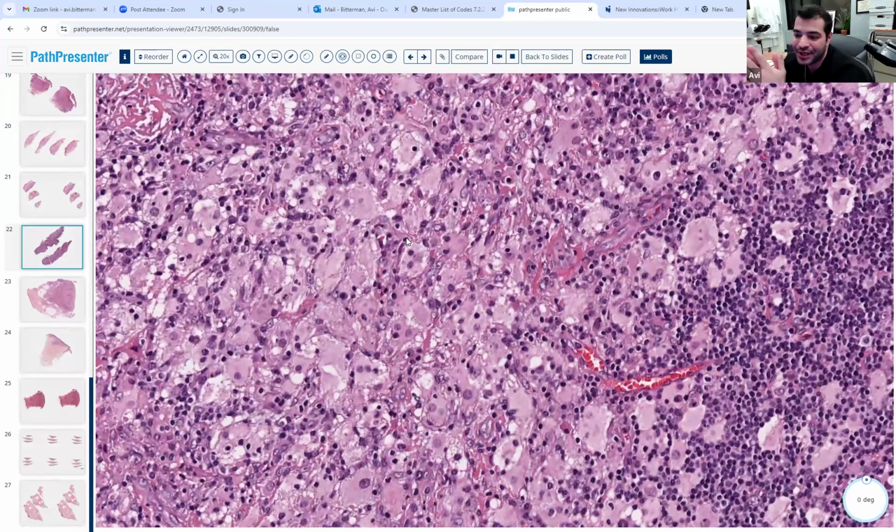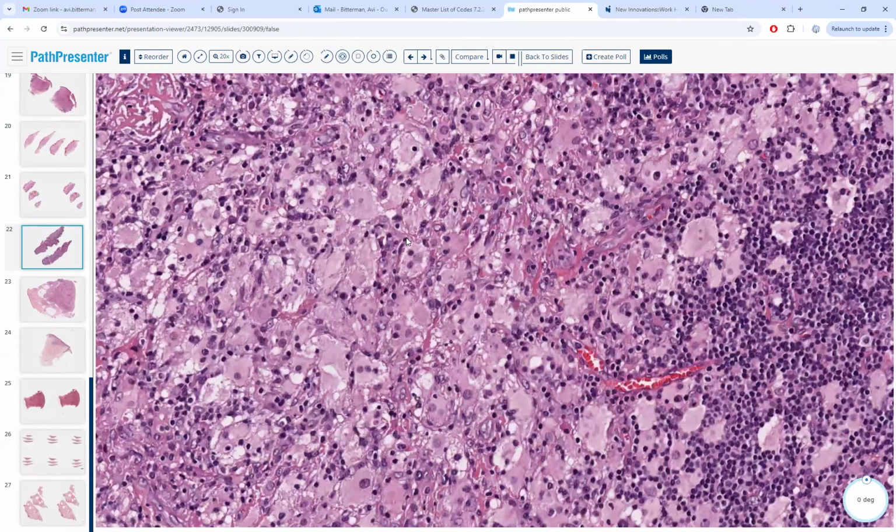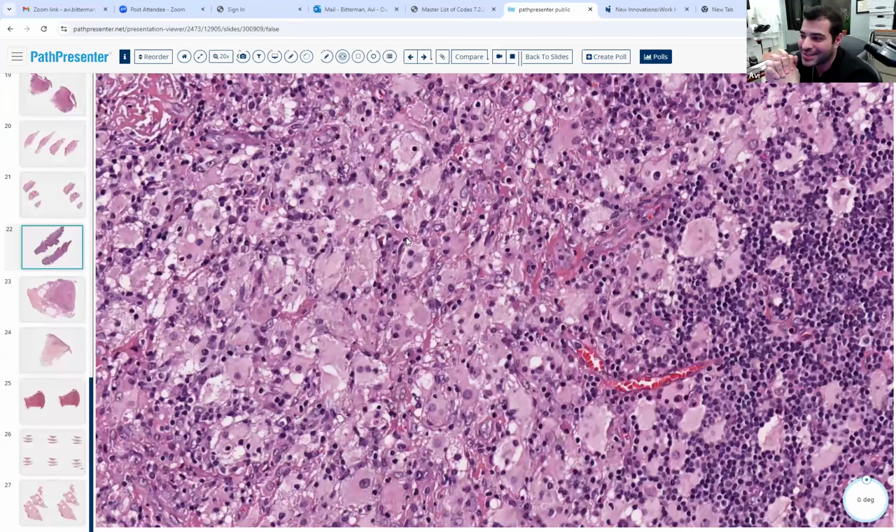So one thing they can test you on are the histiocytic lesions that stain positive for S100. Rosai-Dorfman is one of them. What's another histiocytic lesion that stains positive for S100? Well, there's indeterminate cell histiocytosis, Langerhans cell histiocytosis. Both of those stain positive for S100. What if you took a lesion from the tongue? Granular cell tumor. Yes, that'll stain for a histiocytic marker, and it'll also stain for S100. So that's another thing they may like to test.